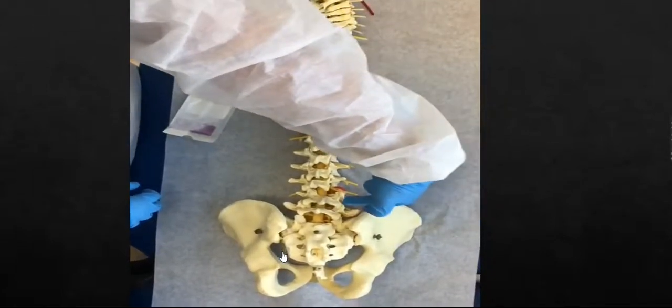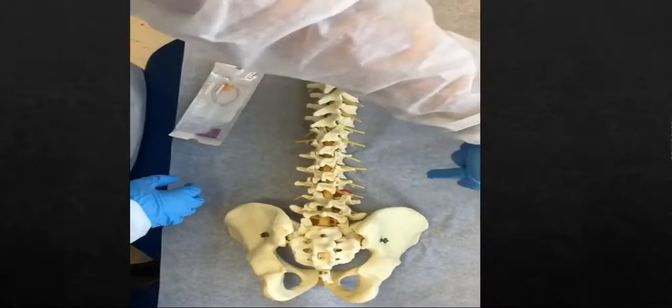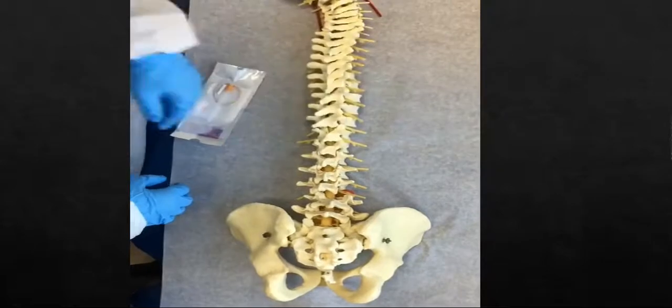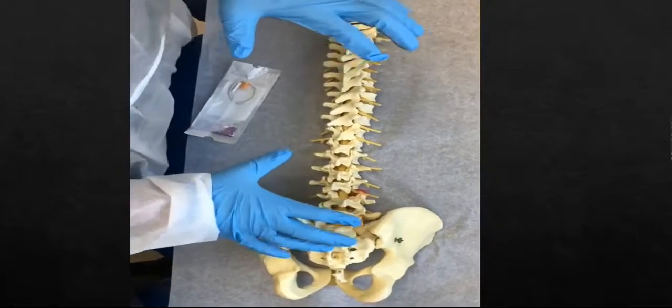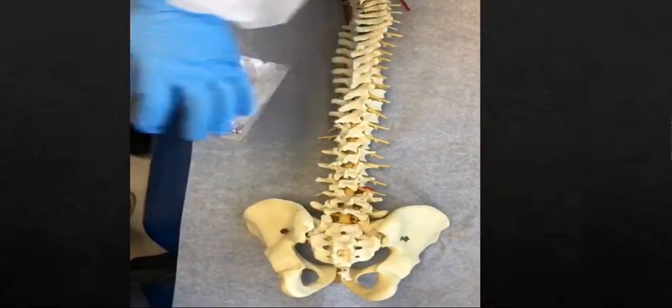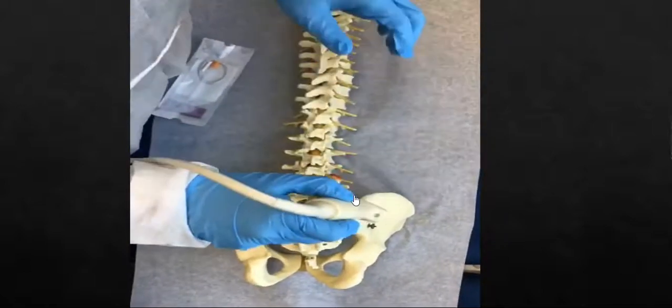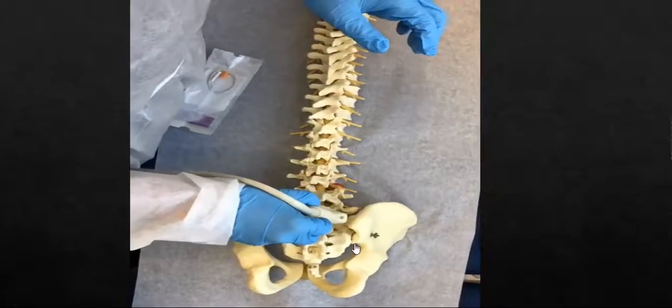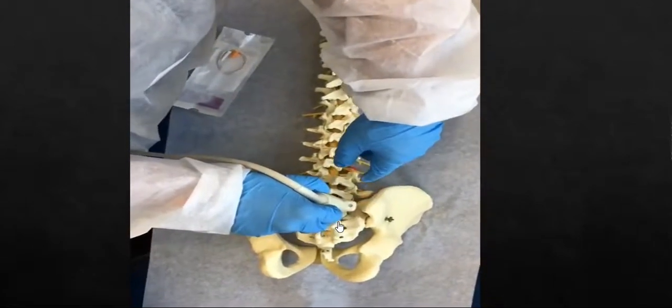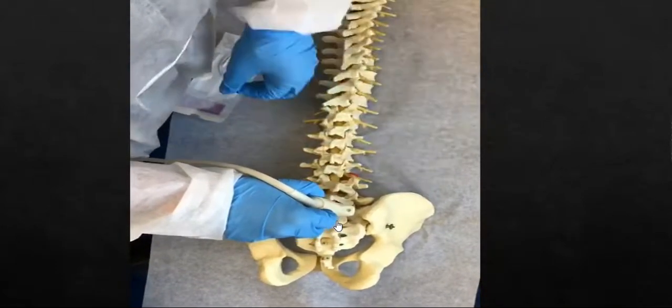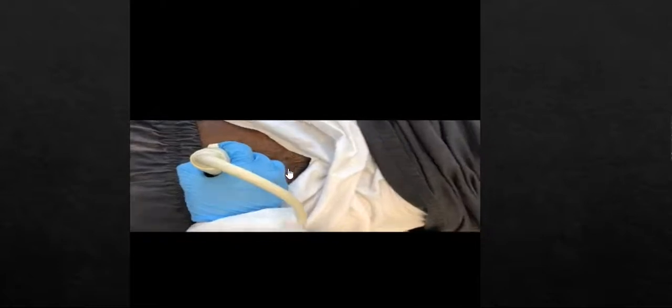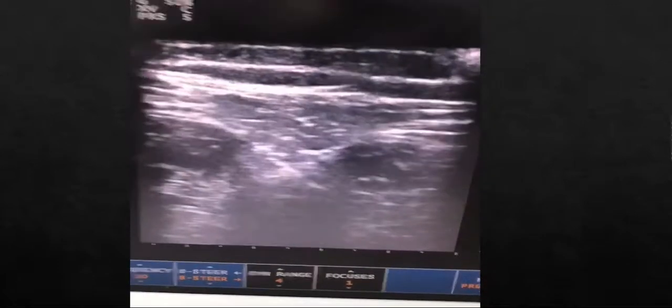Let's say that you want to be more safe and accurate, and you want to use diagnostic ultrasound to get a better picture. You're going to need a diagnostic ultrasound and you're going to use a transverse view to visualize the spine of the patient. You're going to use the pictures in the machine to guide your needle insertion. This is a patient, that's the spine, and we got the diagnostic ultrasound. Now I am localizing the vertebrae so I can find the entry point safely and accurately.